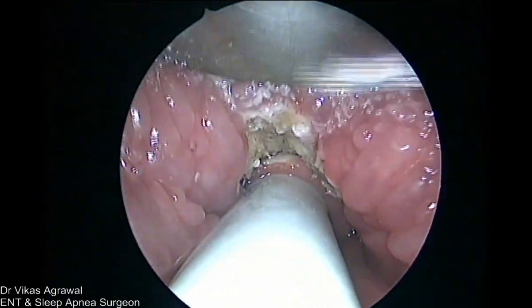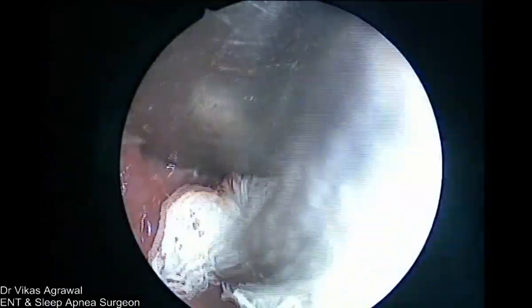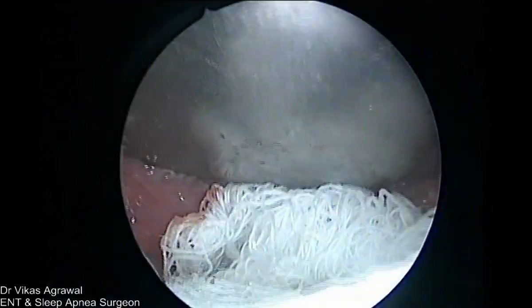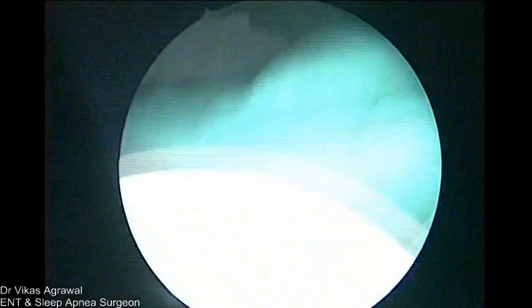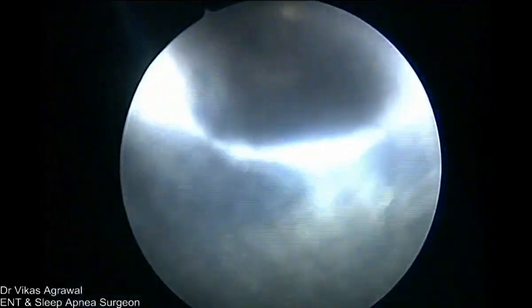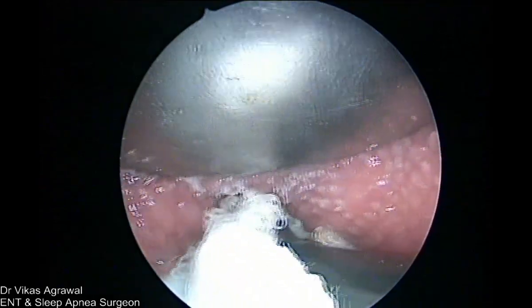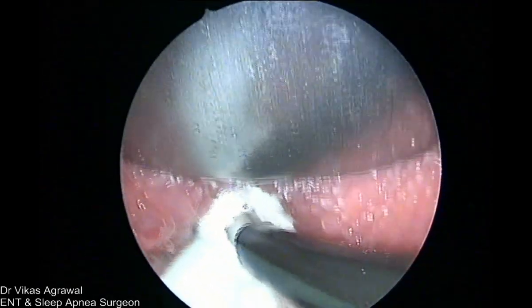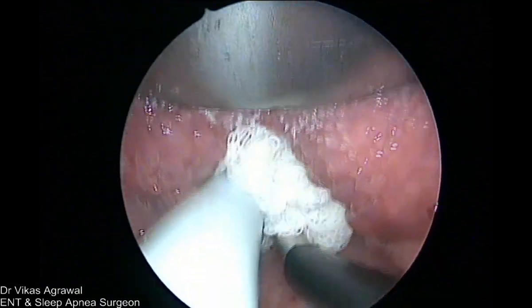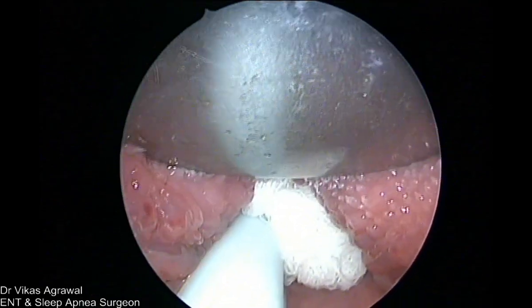We'll just keep it for half a minute to make sure that there is no bleeding. It's just a sense of satisfaction. There's nothing else, and this cannot stop bleeding. But typically we have been doing it, so I'm doing it. This is a hemostatic agent, which I'll just keep for a minute or so, half a minute, and then we'll remove it, and then Kalpesh will extubate.